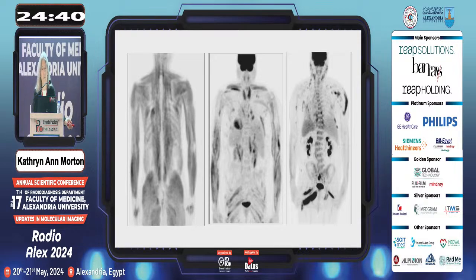These are 3 separate patients. This is one I showed earlier. That's a patient who had taken either carbohydrates or could have taken insulin prior to being injected, with diffuse skeletal muscle uptake. This patient has a very strange pattern with diffuse streaky uptake within muscles. This patient actually had polymyositis.